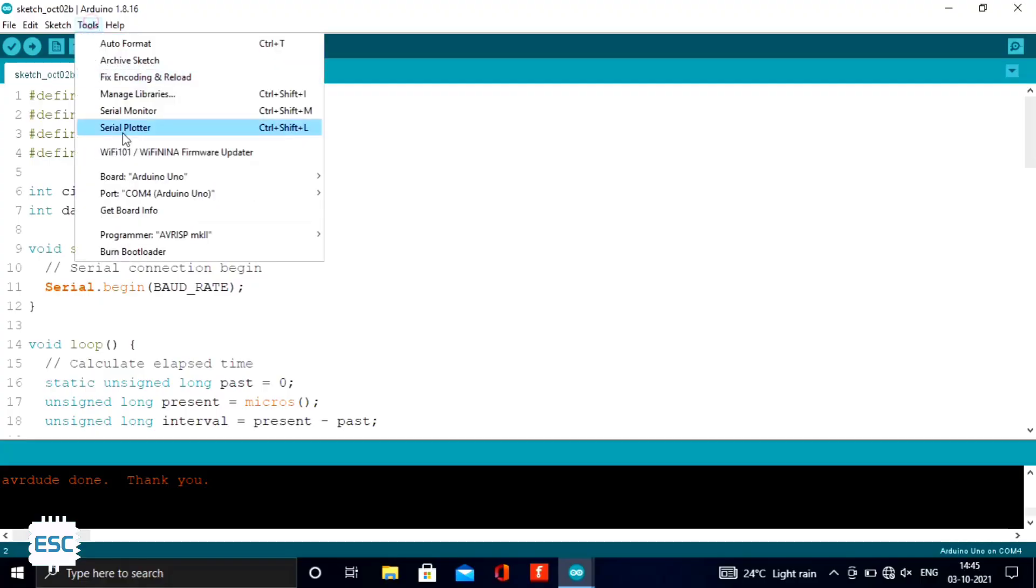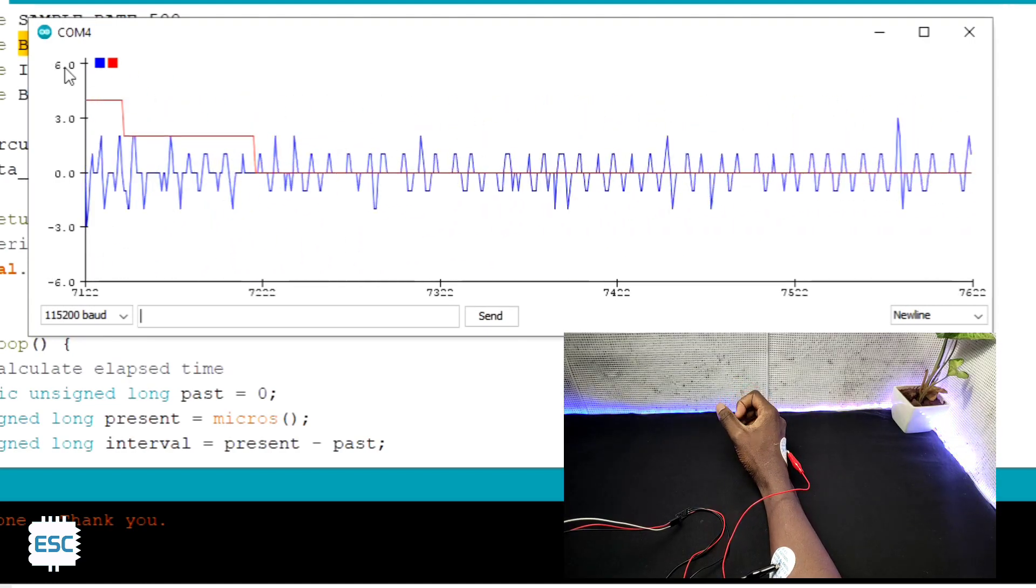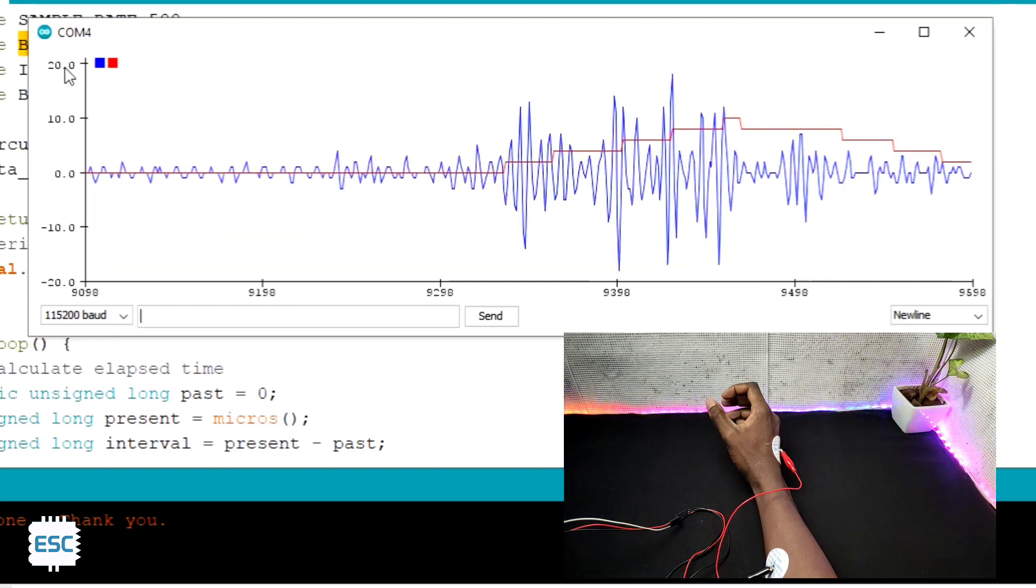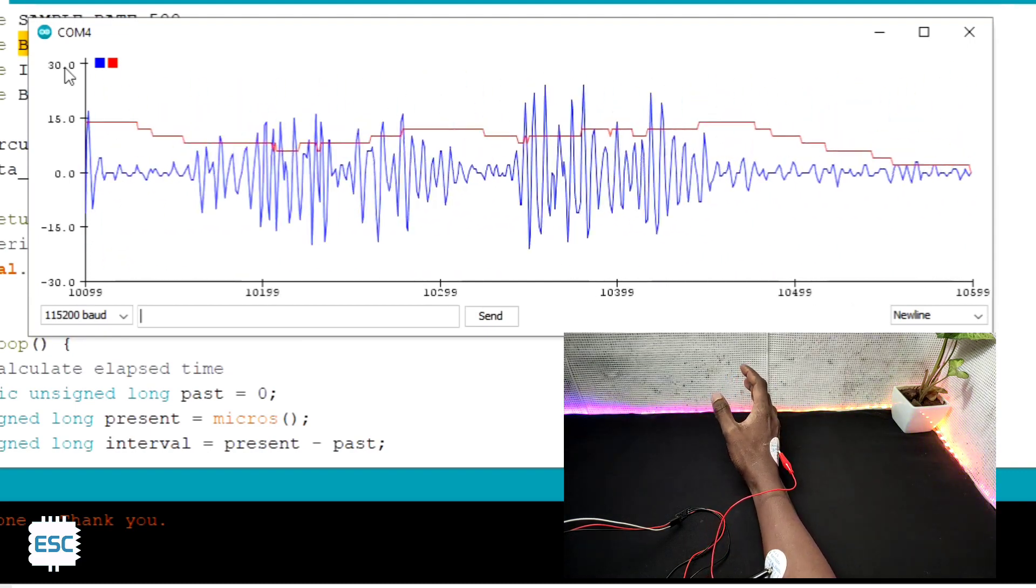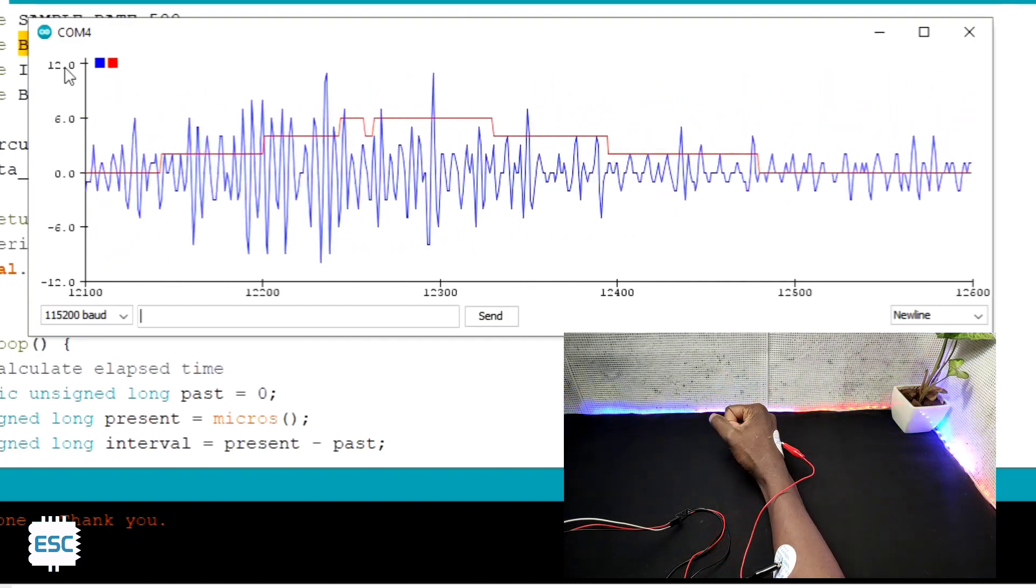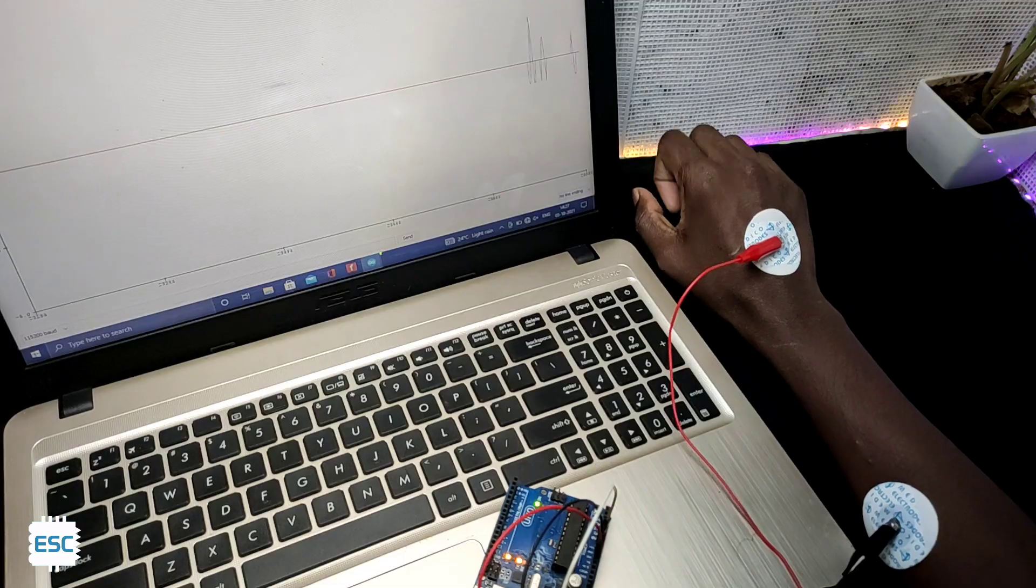After that, I uploaded the sample code to Arduino and opened the serial plotter. Here you can see the graph. Yeah, this is my EMG. You can see the variation according to my hand movement. Magic! Perfect.